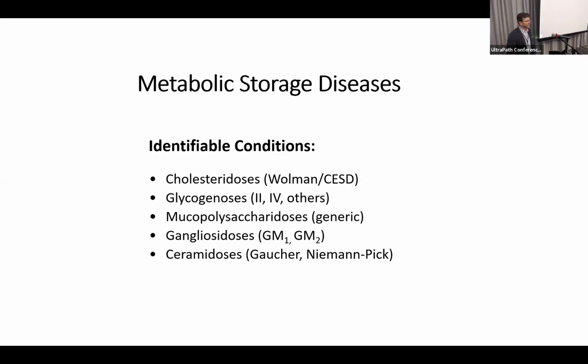And I have one more question. So now we have all these genetic tests done on blood, and the genetic test reveals whatever, and then they do the biopsy, and what you find has nothing to do with what the genetic test tells you. Have you come across that problem? It happens in renal biopsies.